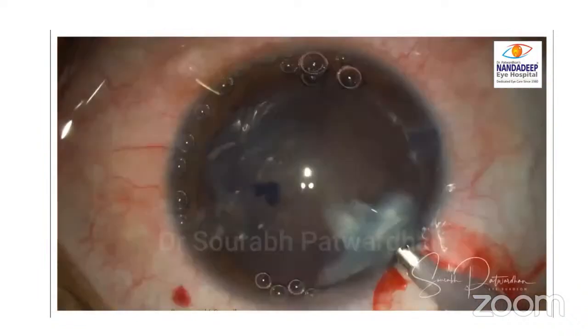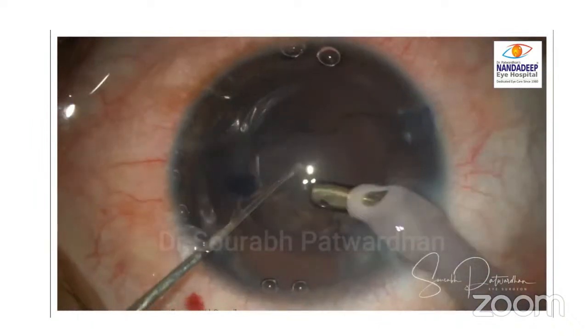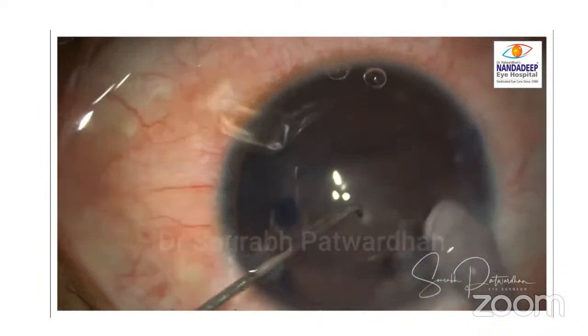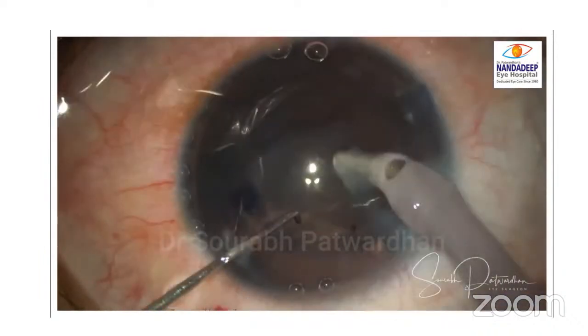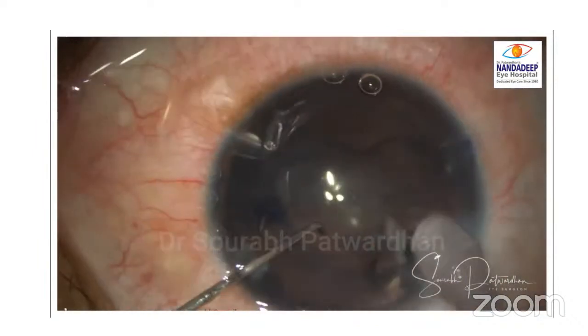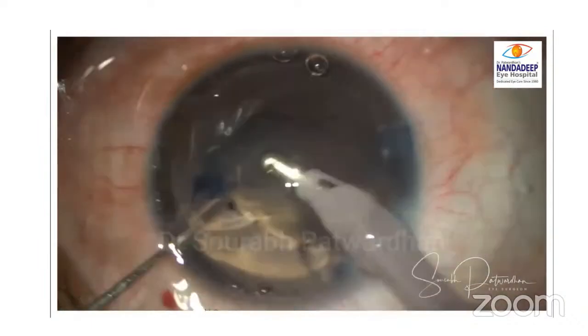In these silicone oil filled eyes, the posterior capsule is generally quite thick because of the presence of oil, and if there is no breach in the posterior capsule during the primary vitrectomy surgery, usually it is very safe and there is very little risk of posterior capsular rupture.